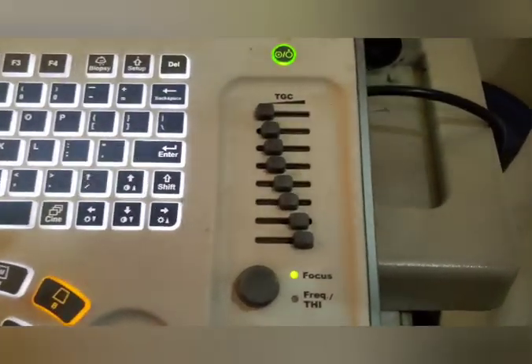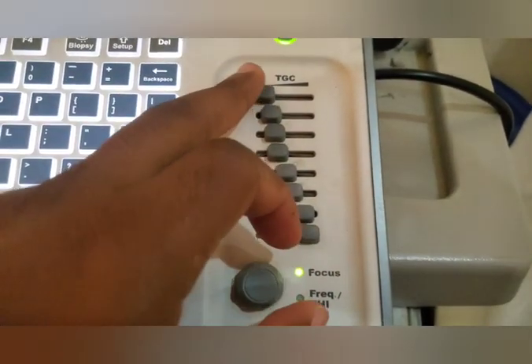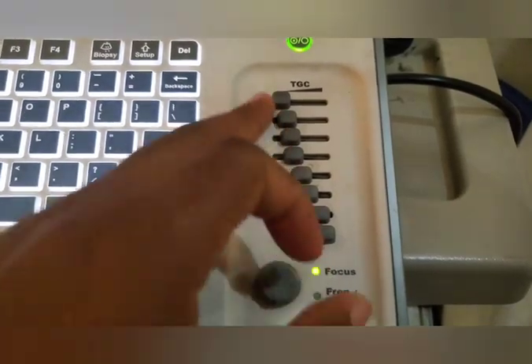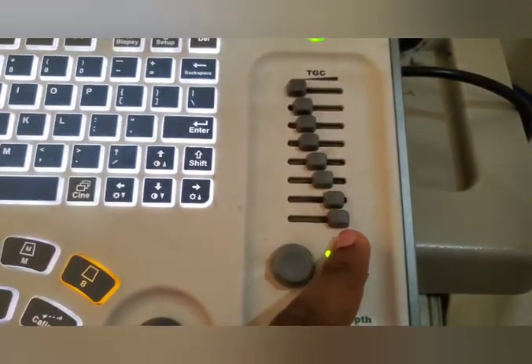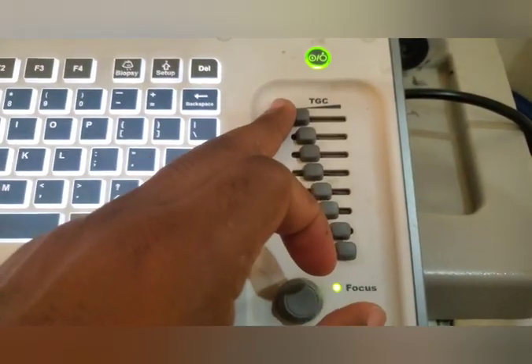We have this position here, which is called the time gain compensation. The time gain compensation is useful because it helps you to increase the resolution from superficial to deep. This is a standard time gain compensation in our institute. Why? Because we are much more visualizing deeper structures than superficial structures.